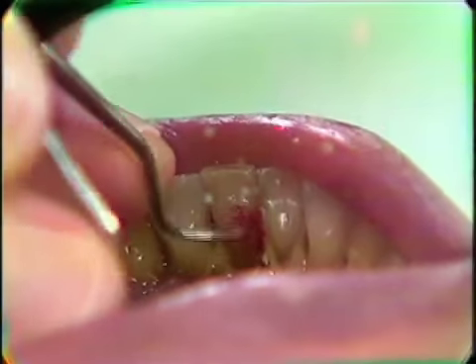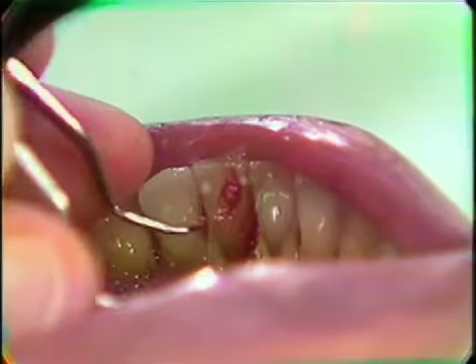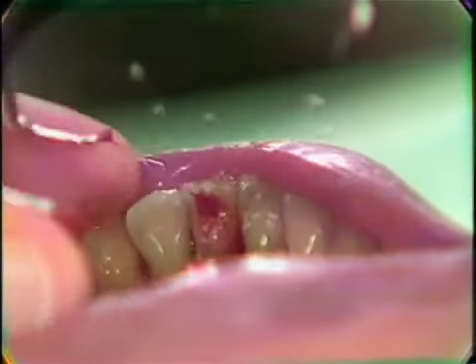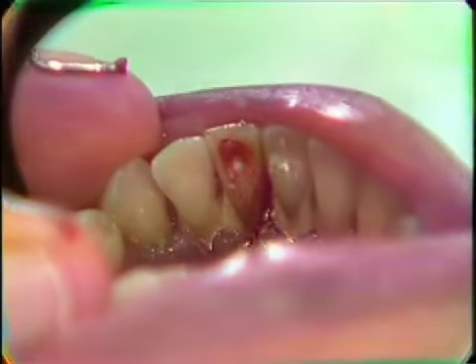Now, once the calculus has been removed, then you should thoroughly flush out the area so that the hemorrhage that's produced does not obscure the cementum enamel junction.